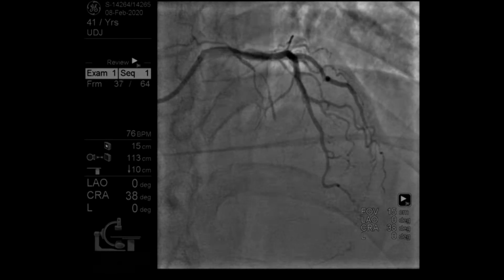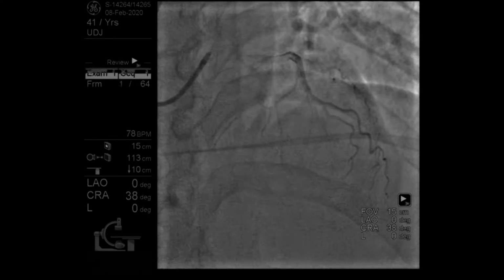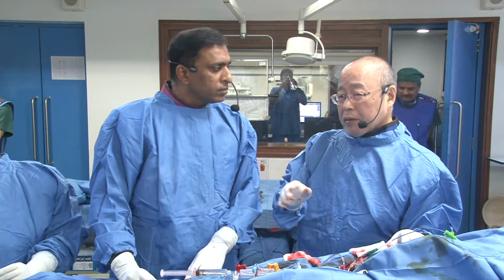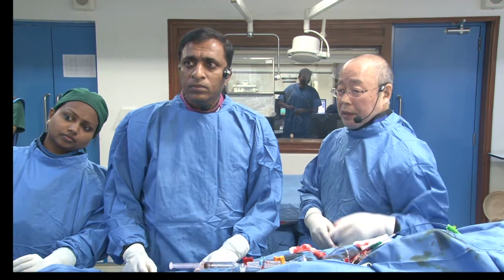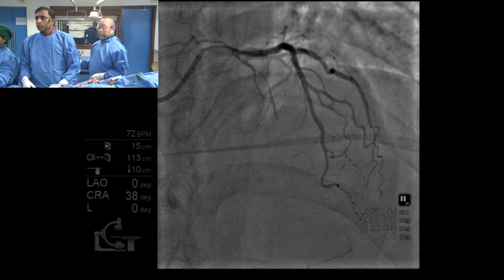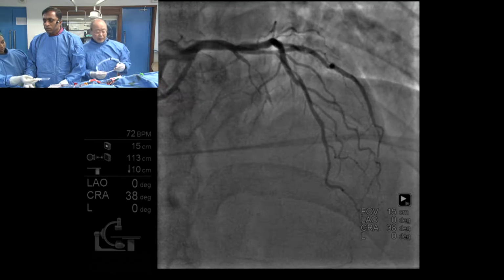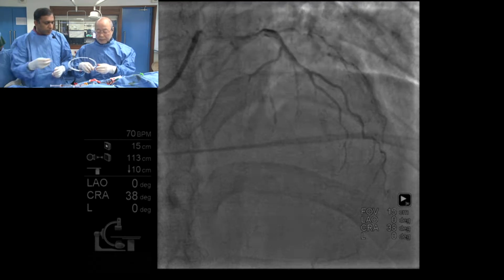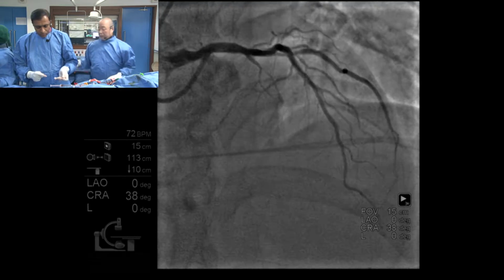This is a patient after the recanalization of circumflex acute myocardial infarction. And the patient has this kind of subtotal occlusion in proximal LAD. So this is the target today. I want to take the XTA with microcatheter. Yes, microcatheter, 135.